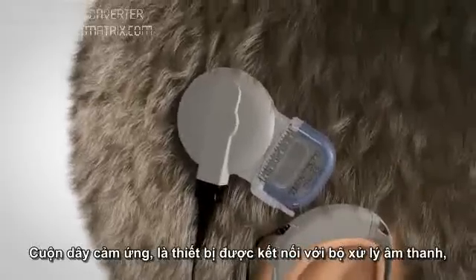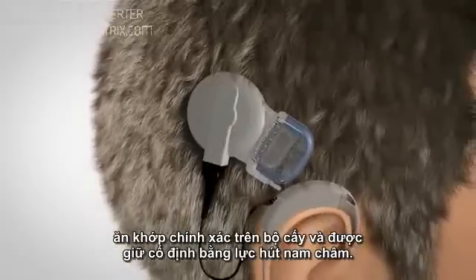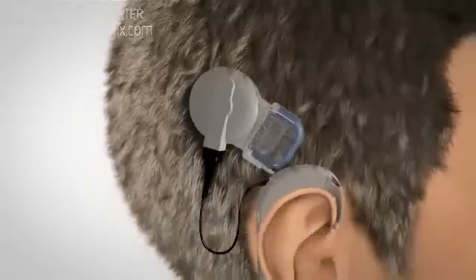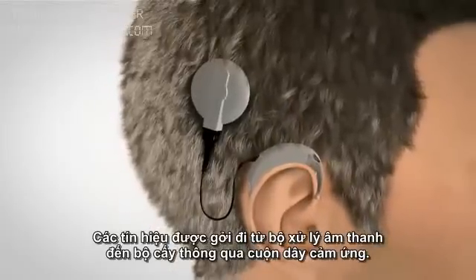The coil, which is connected to the audio processor, fits exactly over the implant and is held in place by magnetic attraction. Signals are sent from the audio processor to the implant via the coil.